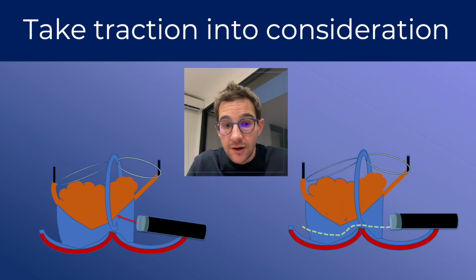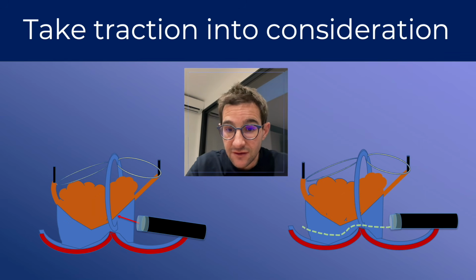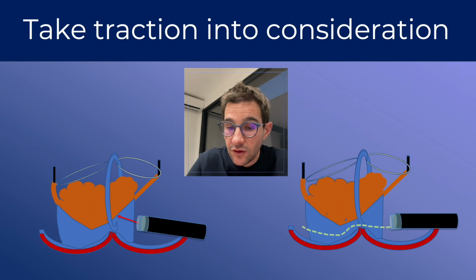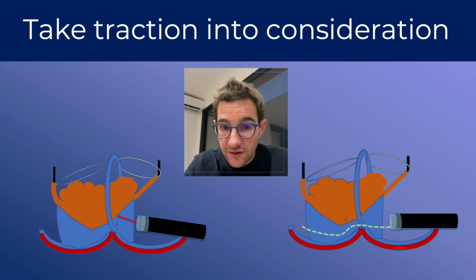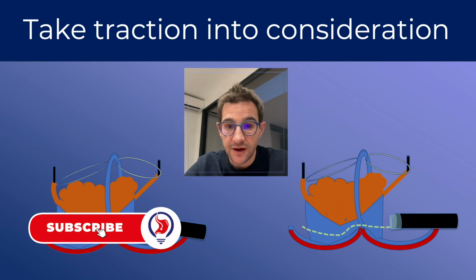Next step, if you use a multi-traction strategy, you will have a reduced angle of the second part of your downhill. It means that instead of going up or going down, you will have a kind of line with a small downhill, and then you will be able to go straight. But all these things should be represented in your mind in order to follow the best line without any contact with the muscle, without any contact with the specimen.